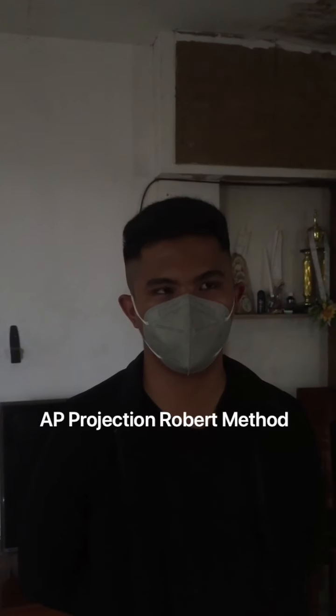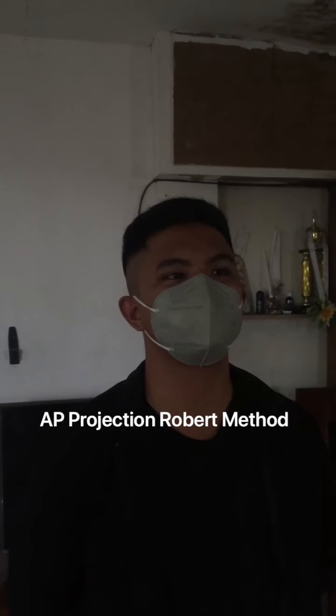AP projection, Robert method. This method demonstrates the carpometacarpal joint of the thumb. This method uses a tabletop technique that requires patients to place their hand in a complex position. The image receptor that we are going to use is 8 by 10 inches. Patient position: the patient sits parallel at the end of the table with hand and arm fully extended.